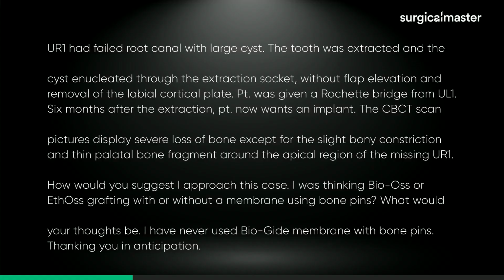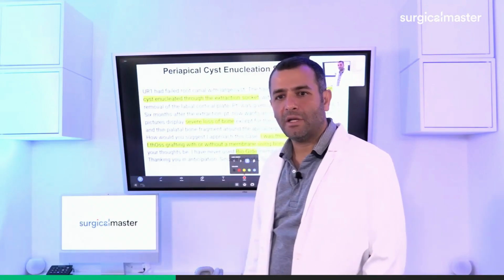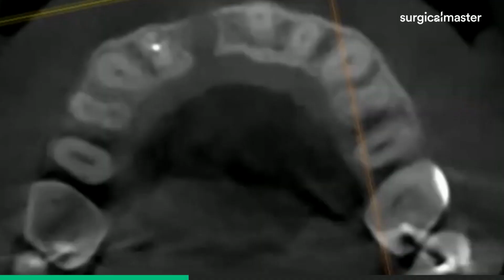The skill sets you need to be able to do a horizontal mattress periosteal suture, and you need to be able to dissect beyond the... It's just a pure vertical augmentation from what we saw in the cross section, Ziv. So I would approach this case cautiously and beware what you promised the patient, because I didn't see any walls in that cross section you showed, Ziv. It was just purely bossed, horizontally.